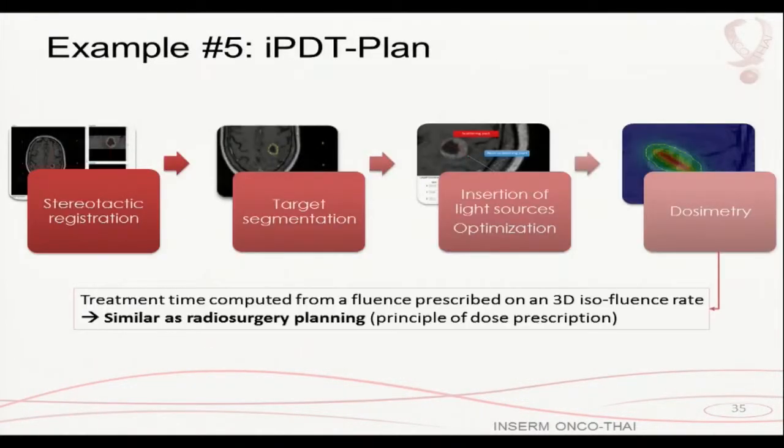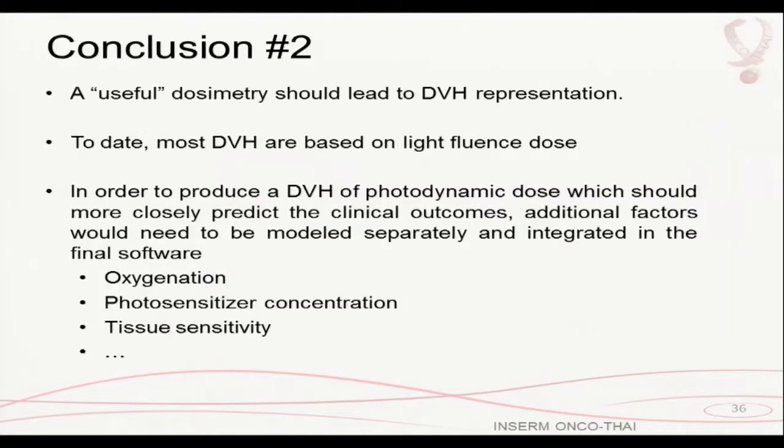And more recently, with Maximilien, Clément and the team, an approach also to perform the dosimetry and determine the dose volume histogram and the dose inside the tissue, which we call IPDT plan, for glioblastoma.